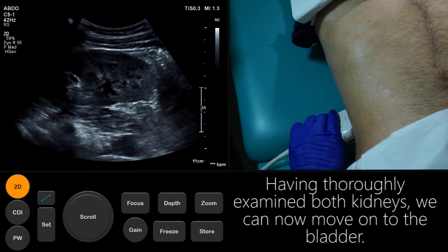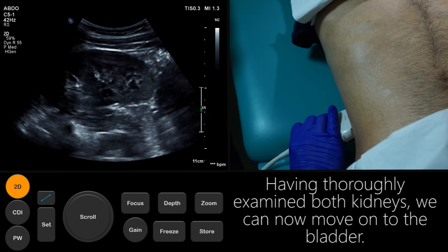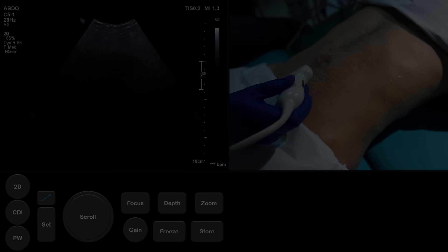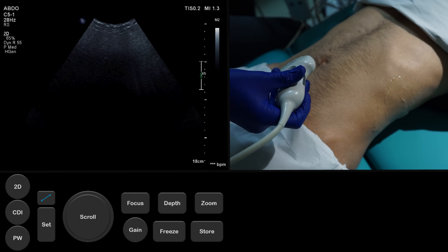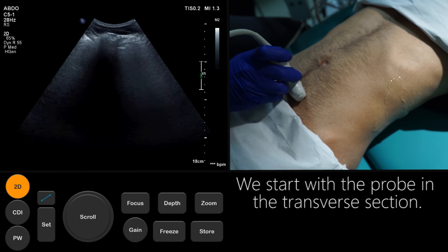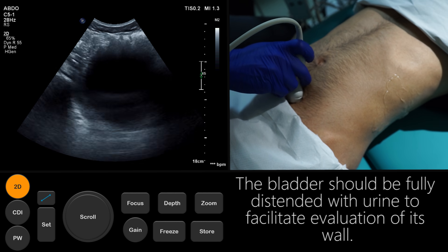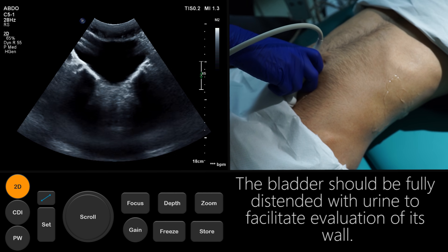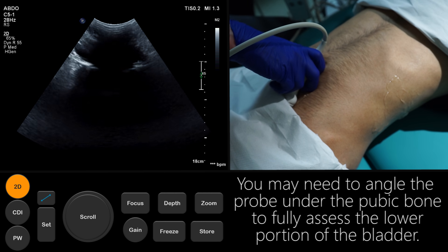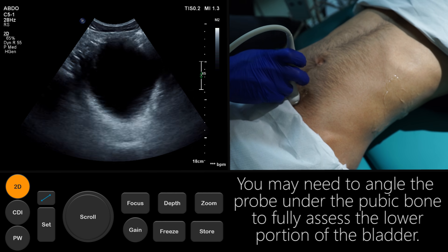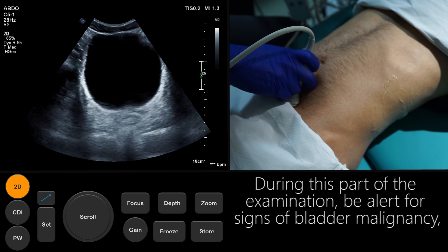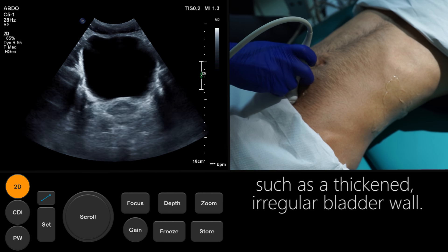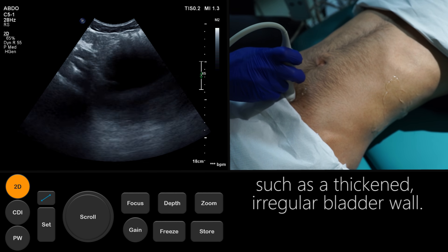Having thoroughly examined both kidneys, we can now move on to the bladder. We start with the probe in the transverse section. The bladder should be fully distended with urine to facilitate evaluation of its wall. You may need to angle the probe under the pubic bone to fully assess the lower portion of the bladder. During this part of the examination, be alert for signs of bladder malignancy, such as a thickened irregular bladder wall.